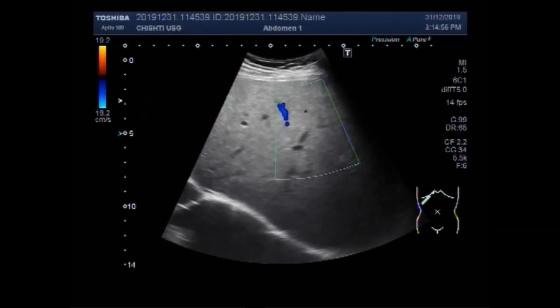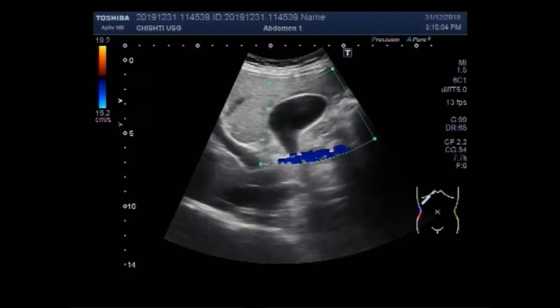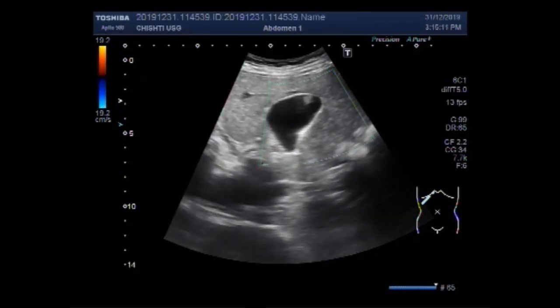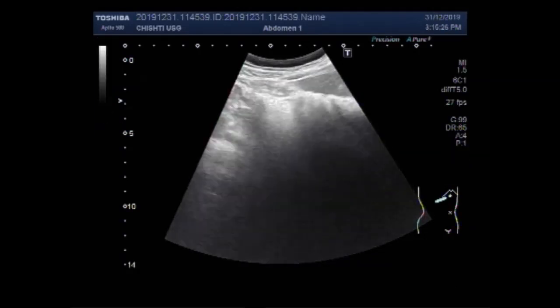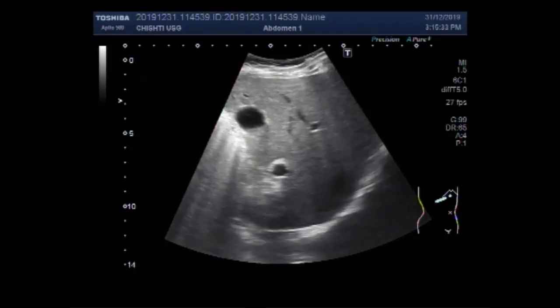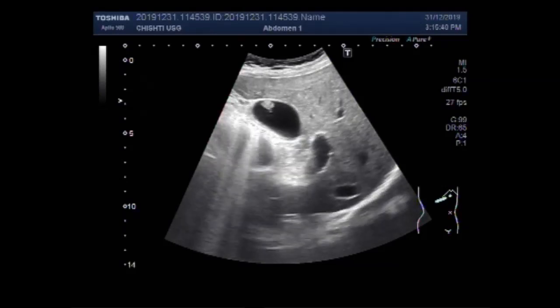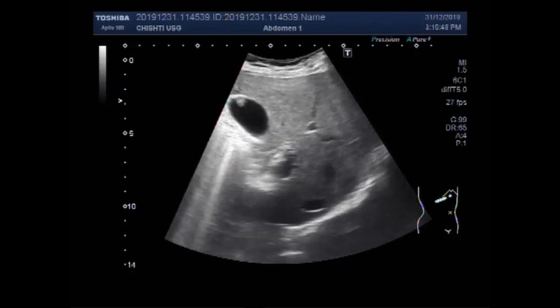Now you can see there is almost no blood flow seen in the gall bladder polyp. Now the position of the patient is changed to the lateral decubitus position. You will see this gall bladder and polyp. Now again you can see the gall bladder polyp attached to the fundus of the gall bladder, and there is no blood flow seen in the gall bladder polyp.